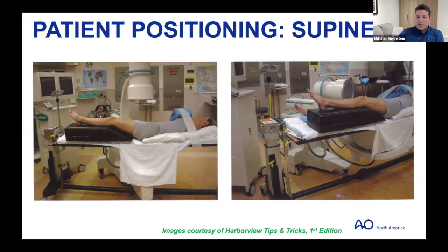Not to stay on this slide, but if you're really paranoid or OCD, also this bump I would critique is not that good because it's folded, so it doesn't have a lot of density and it can get squished. So you really want to have a good blanket that's tightly rolled, that doesn't lose its shape. Don't make fun, I'm being serious. And then, like you said, not too big or too small.